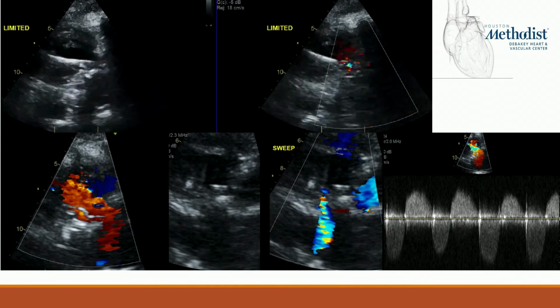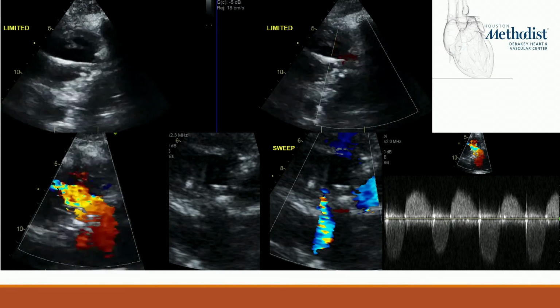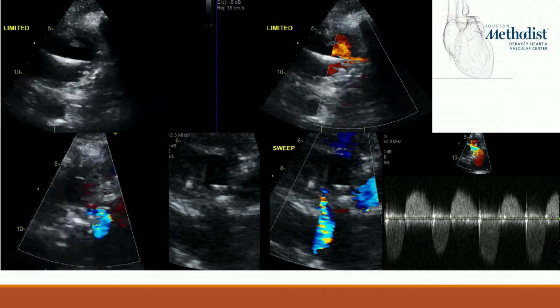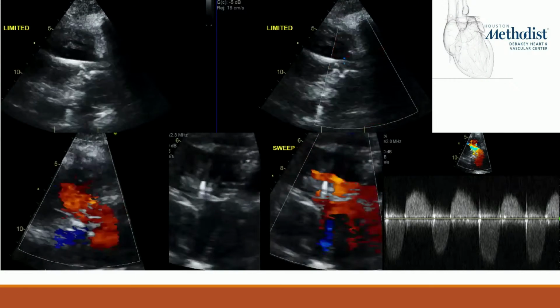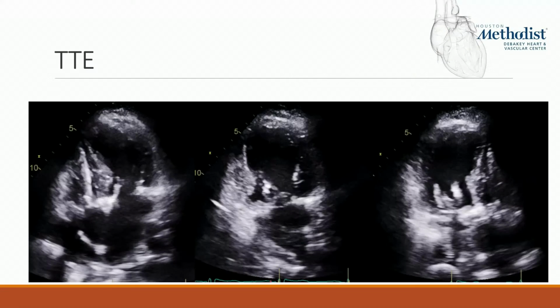And her tricuspid valve, the bioprosthetic valve, showed mild regurgitation with increased gradient across the valve of 5 millimeters of mercury at a heart rate of 70. Which brings us to the echocardiogram at the time of presentation, when she presented with the symptoms of right-sided heart failure.